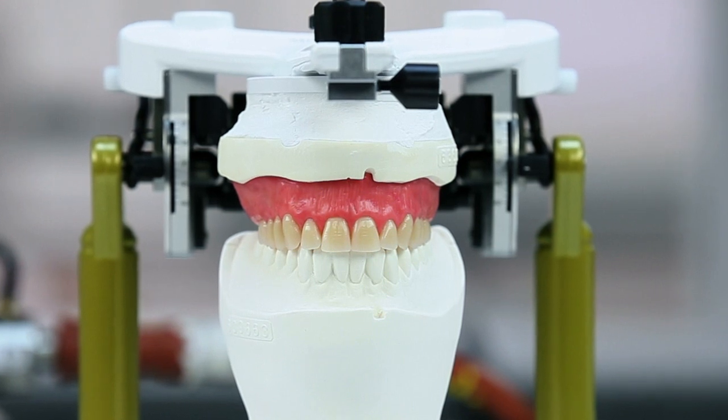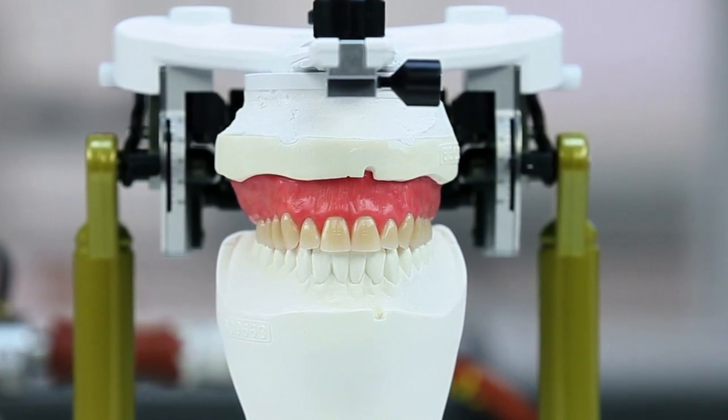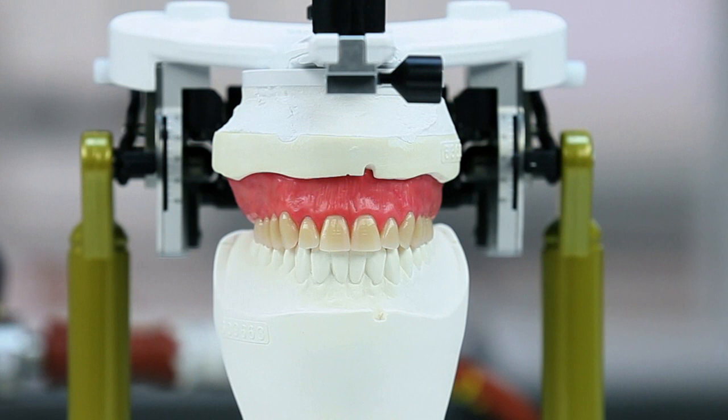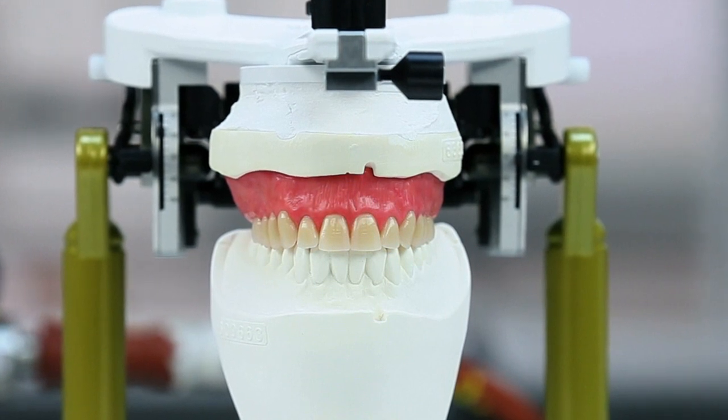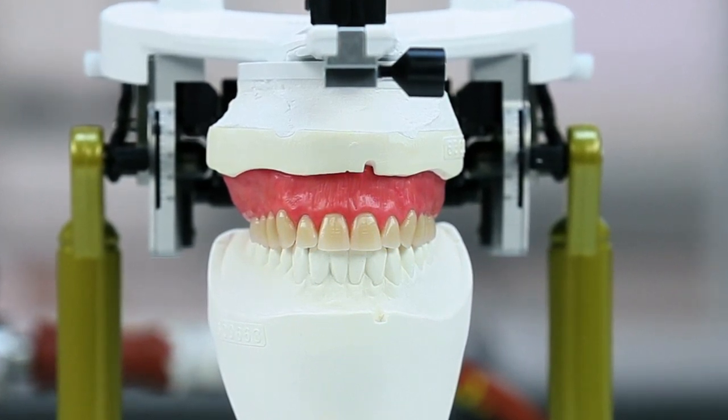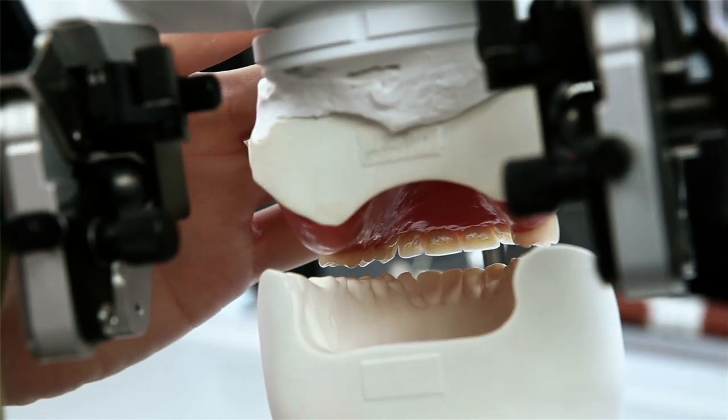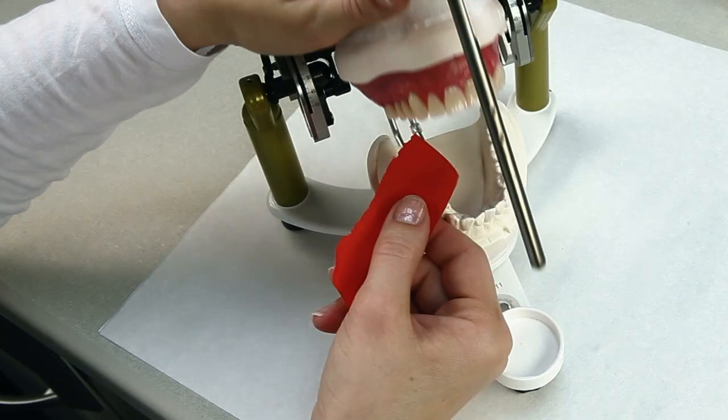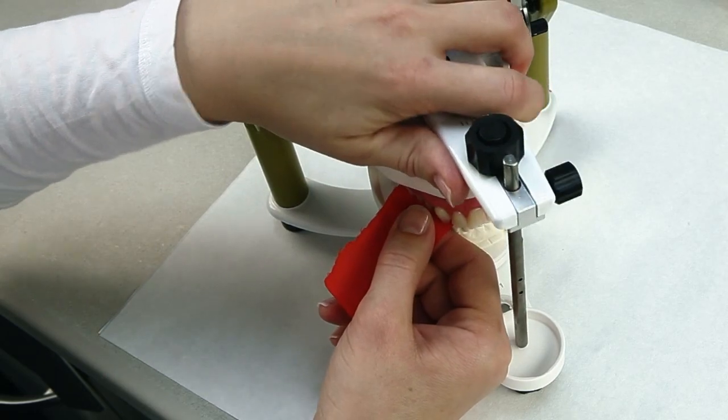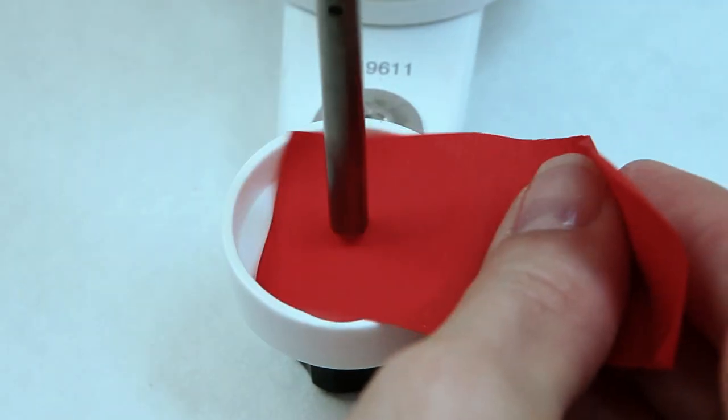The anatomic contouring should correspond with the future completed dentures to as large an extent as possible. This will help you save time during subsequent finishing. Check the wax-up in the articulator after try-in. The contact points in the occlusion should already be established at this point.